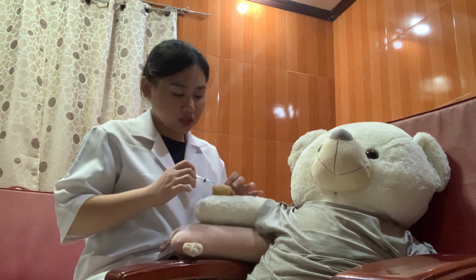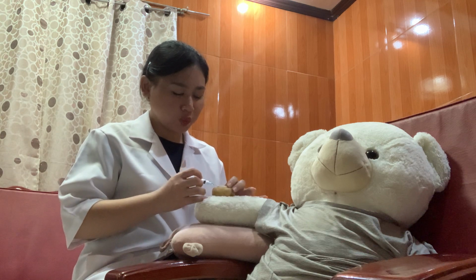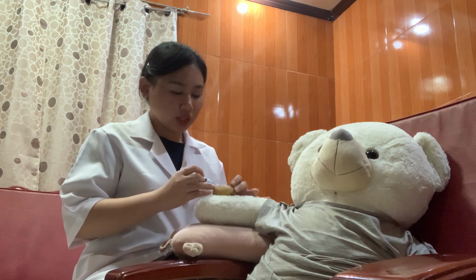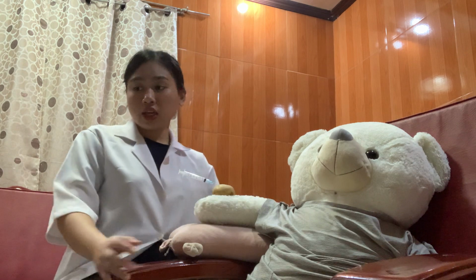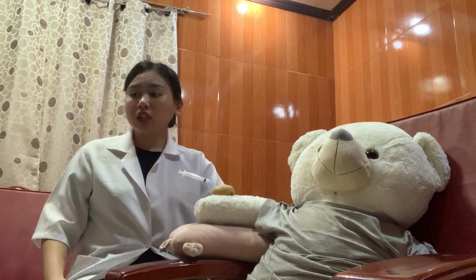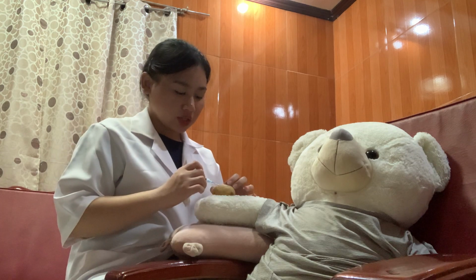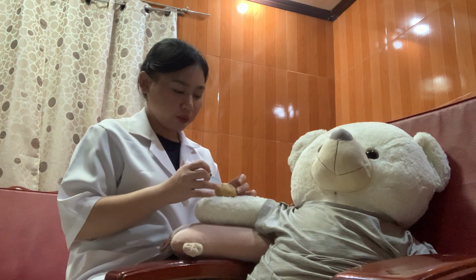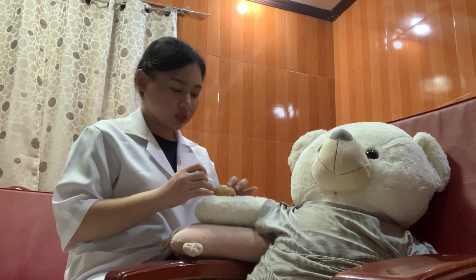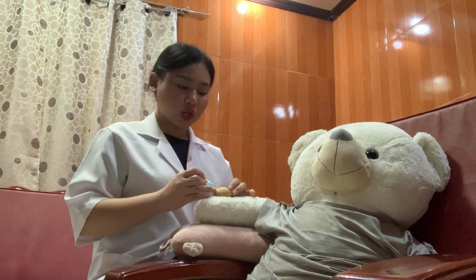The certainty of the position is more important than the entry point. The pulsation of blood into the syringe verifies that the artery has been punctured.